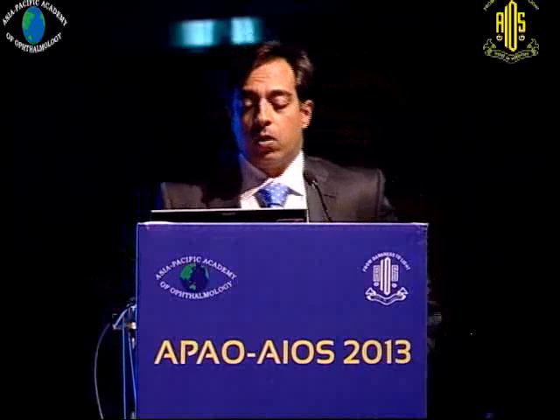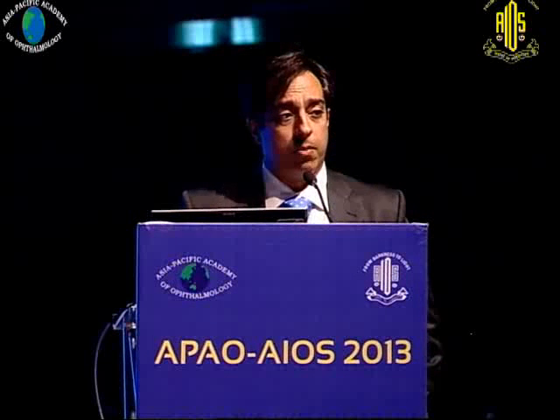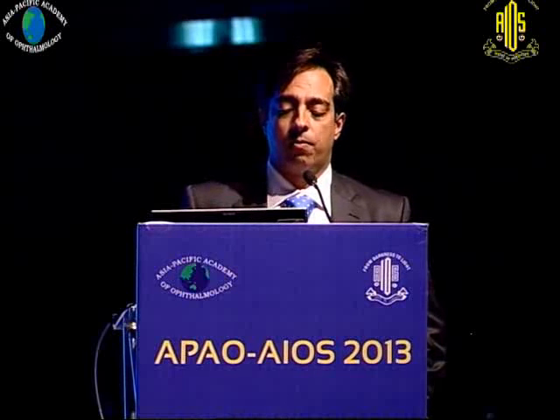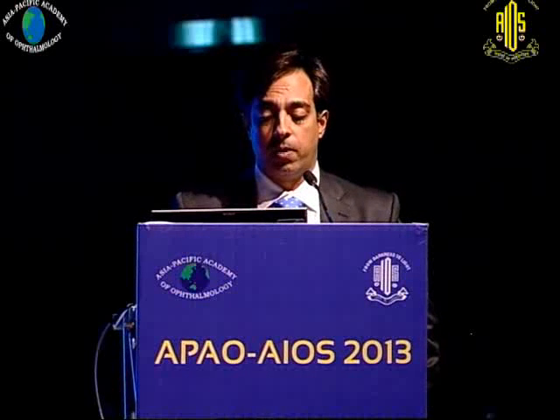Anyways, so here how we approach it is that you segment the small skirt and then remove it by removing the ILM rather than trying to pinch and remove it totally, and you can see that it comes off very comfortably along with the scaffold of the ILM, because that's where the hyaloid is attached in the first place.